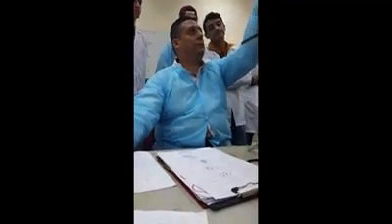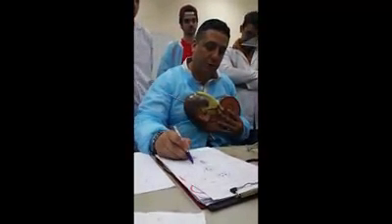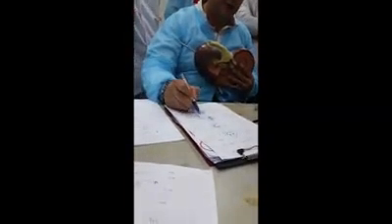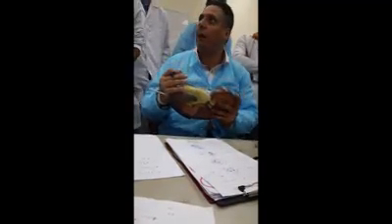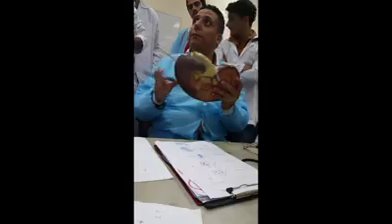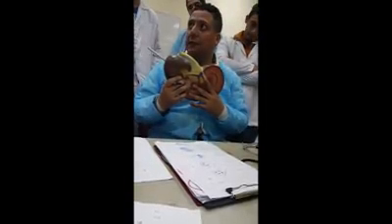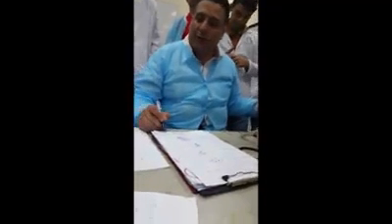This one is very hard to do. It looks more or less like this shape, but I find it a bit larger. It looks somewhat like the shape of an apple, as I have drawn to you. Anyway, if you find this shape, this is the monocyte. Monocytes make up 5 to 6%.